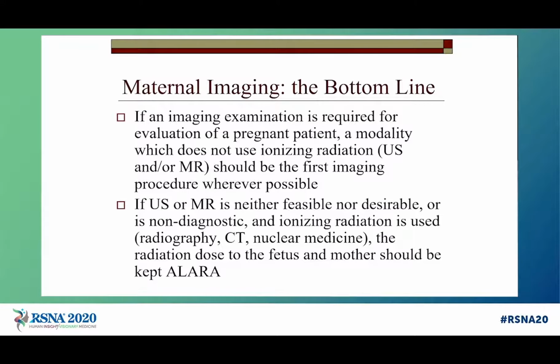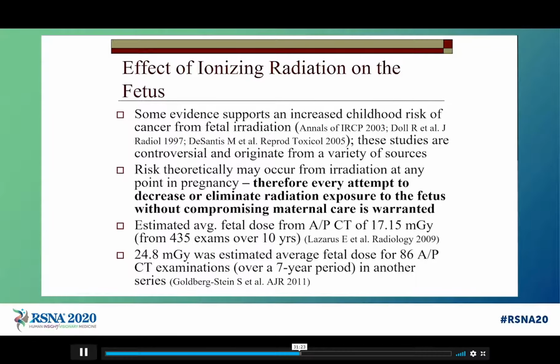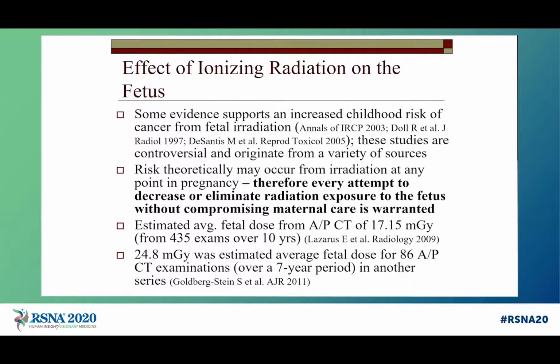If they do use ionizing radiation, we want to, of course, reduce the dose to both the fetus and the mother as low as we can get it without compromising diagnostic accuracy, so the ALARA principle. And typically, we're talking about low radiation dose CT, occasionally radiography. Time does not permit a detailed discussion, but there are areas of great controversy here in terms of whether ionizing radiation in utero leads to an increased incidence of childhood malignancy subsequently. Although this is very debatable and mostly theoretical as opposed to actual data, just from a public relations point of view, quite honestly, it's ideal to reduce dose or eliminate it if we can.